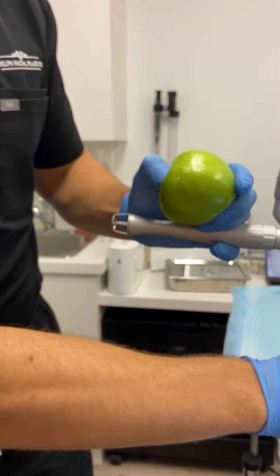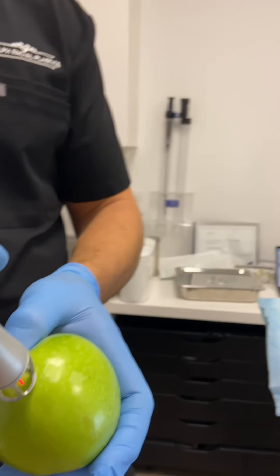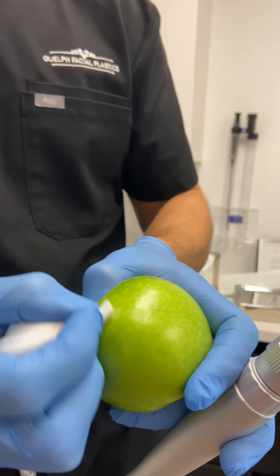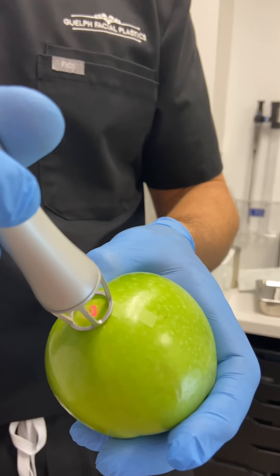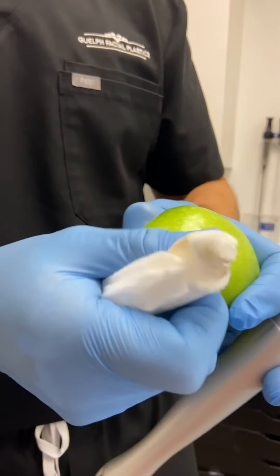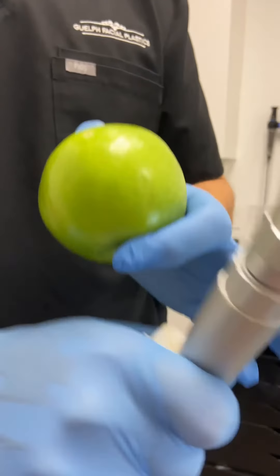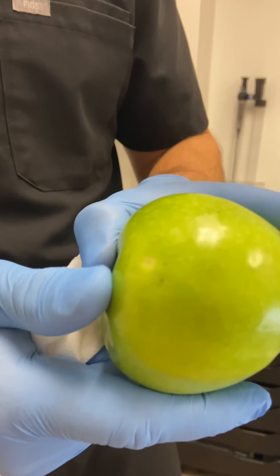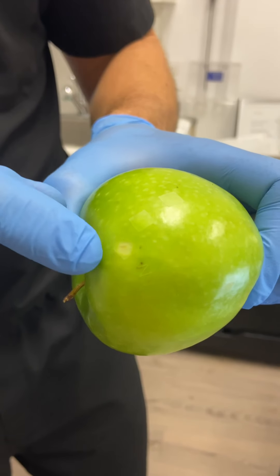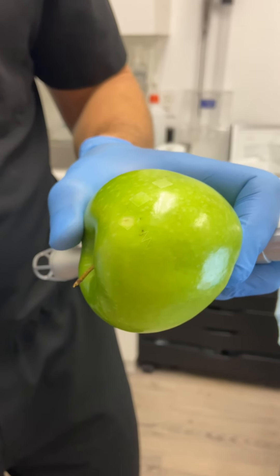As the blemish gets smaller and smaller, we can change our spot size — one of the reasons I love this laser is it's very customizable. We're just hitting the one spot that remains. The skin of this apple is still intact; I'm not into the flesh yet. If I keep going, I will, and that's kind of like someone's facial skin — we can get through the epidermis layer by layer until we hit the dermis. That's okay as long as we stay in the superficial papillary dermis; it will heal just fine. With one pass I removed that brown spot, two passes for the next, and this one took about four.